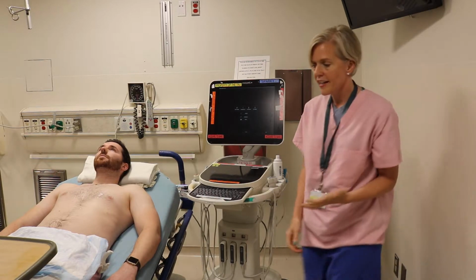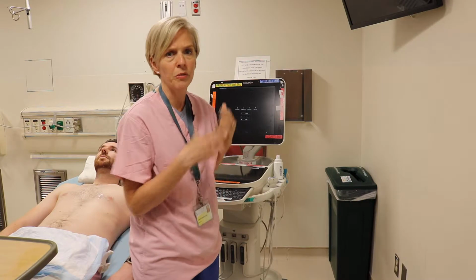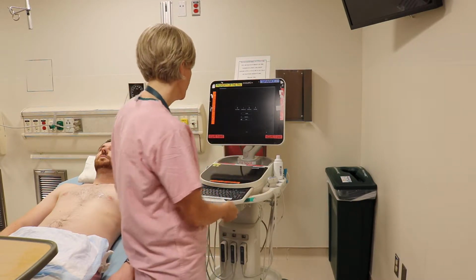It is a guaranteed fact that if you don't plug in the machine, every time you use it and every time you stop using it, your machine will die and then it won't be useful anymore.